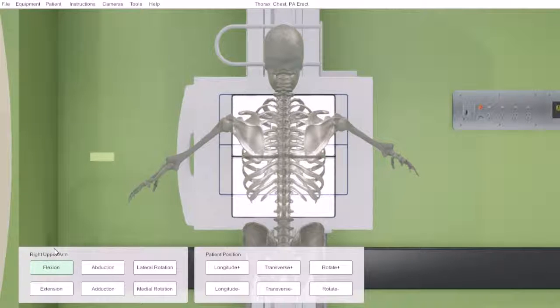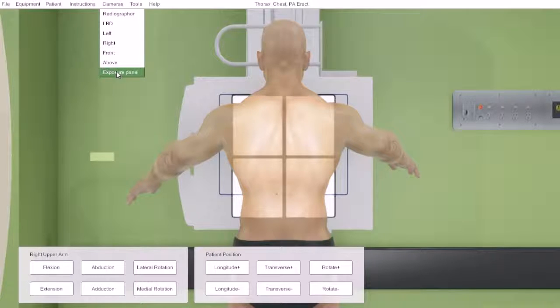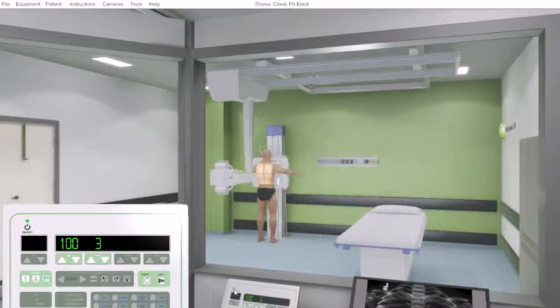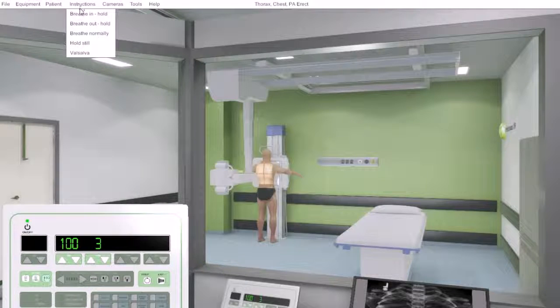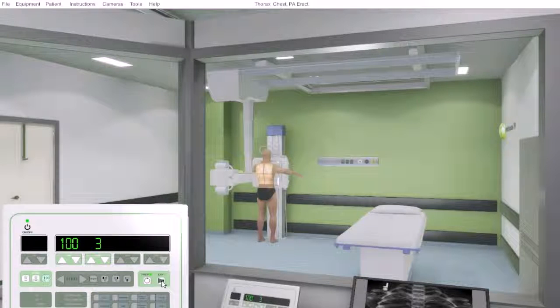Once the student is happy with their selection, they can go to the console, select their exposure factors, engage in breathing instructions, and take an image.